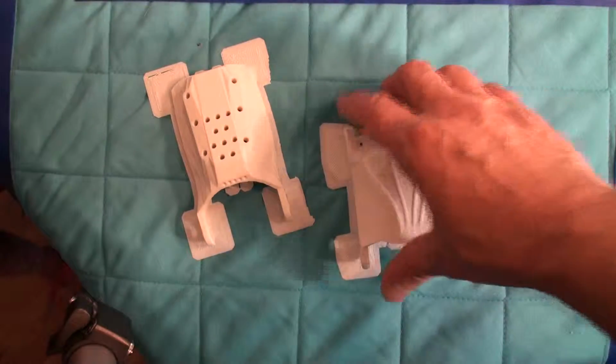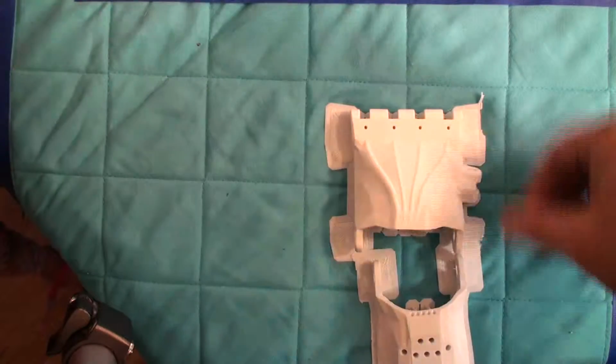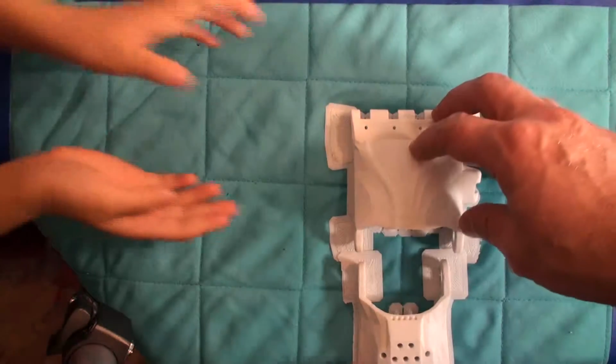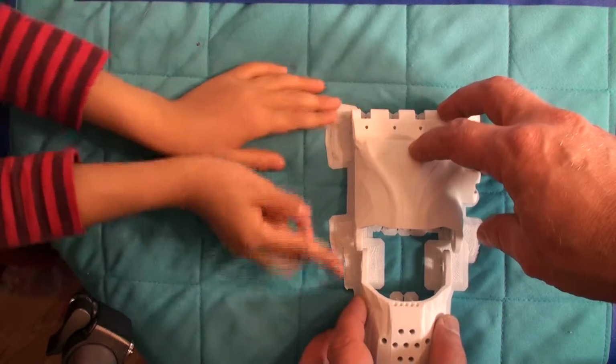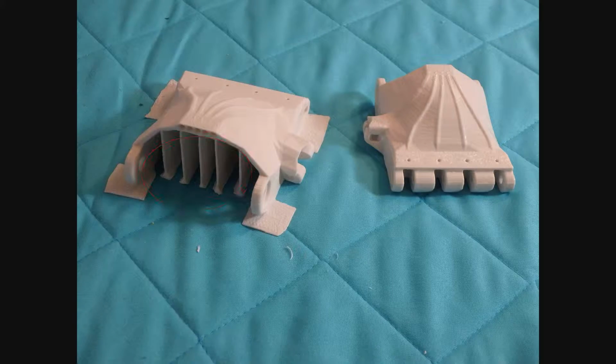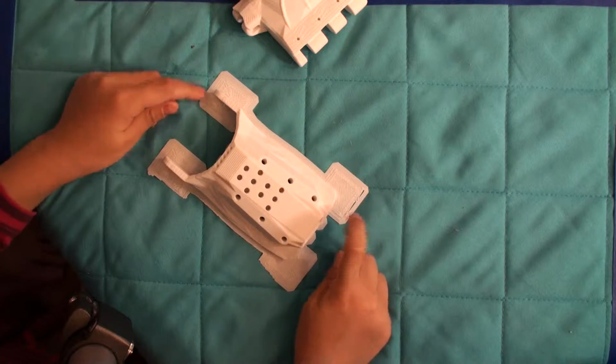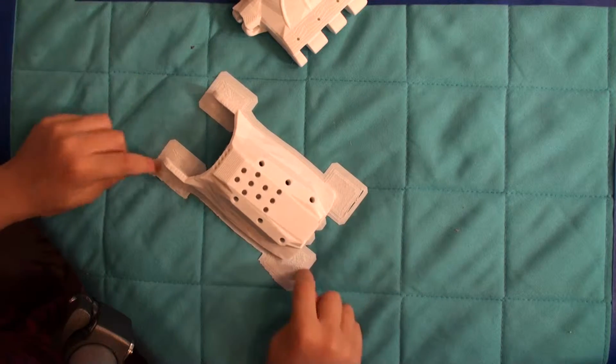For the Osprey and the Gamma Raptor, the large palm and bracer components have the same kind of built-in support. Thin walls support the interior of the arch, and gecko pads help the model stick to the bed during printing. But we don't use these parts for the hands.